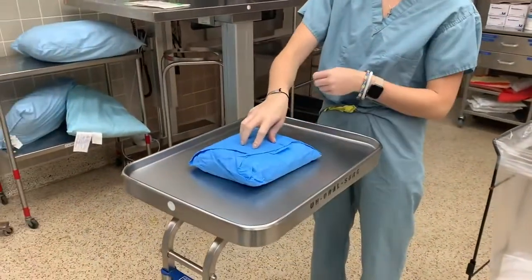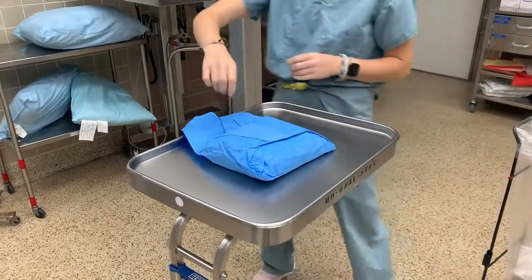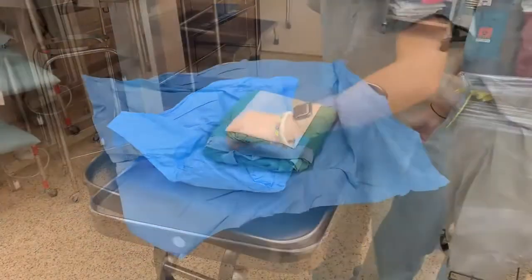Place the package on a flat surface. Make sure the folds are facing up when you do this. Then grab each tab to unfold the package, being mindful to maintain sterility. When you are finished, you will now have a sterile field.